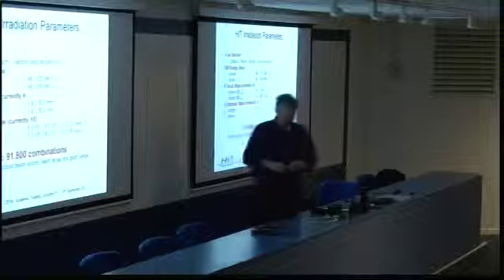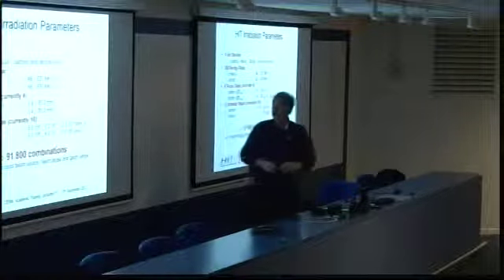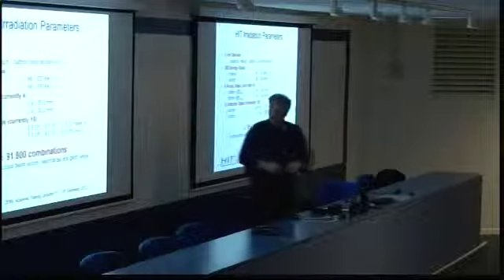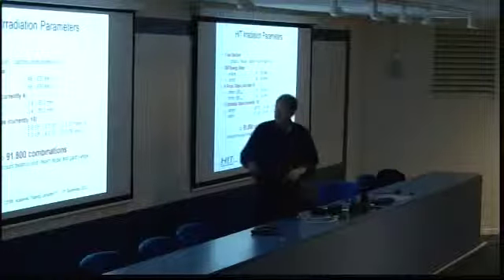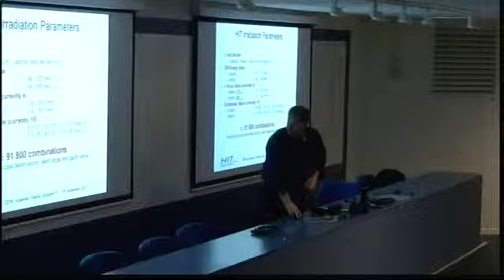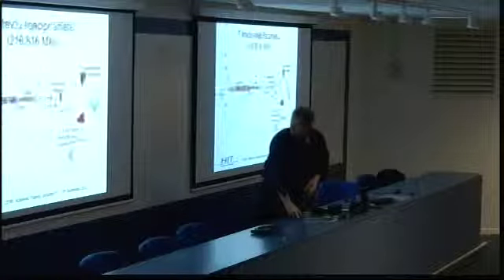This is around 90,000 combinations which have to be pre-commissioned in the control system, and you can have a knob and say, I want to have number 60,133, and then you get the beam that has, let's say, 200 MeV protons, focus 3 or something like that.